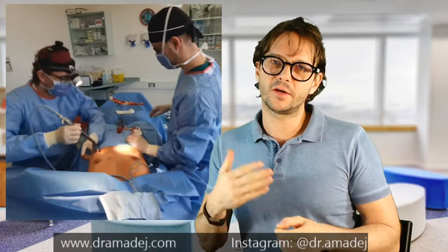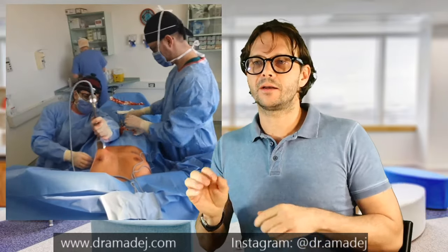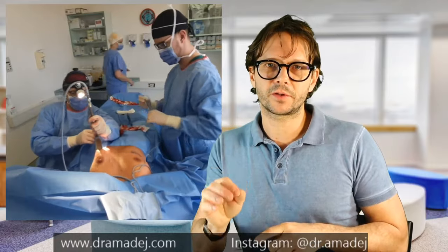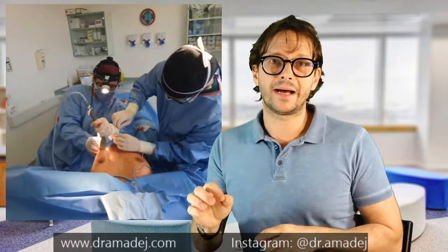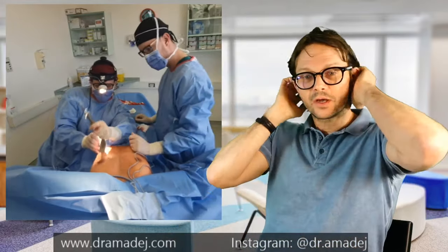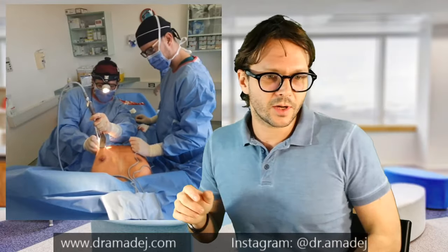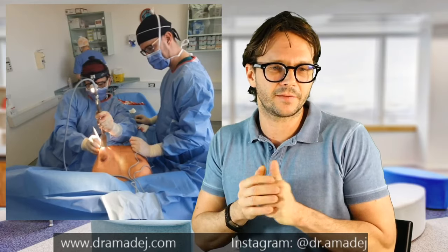Of course, before coming to the clinic on that morning, the patient is not allowed to eat or drink anything. A few sips of water or clear tea are allowed, but she should eat absolutely nothing. We are still finishing the pocket on the left side.